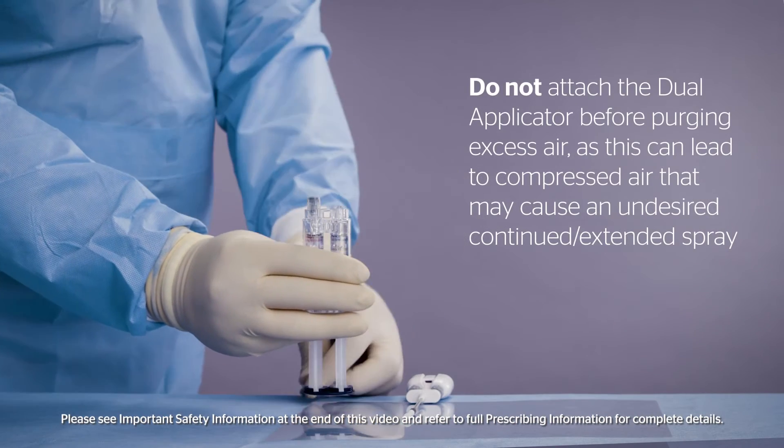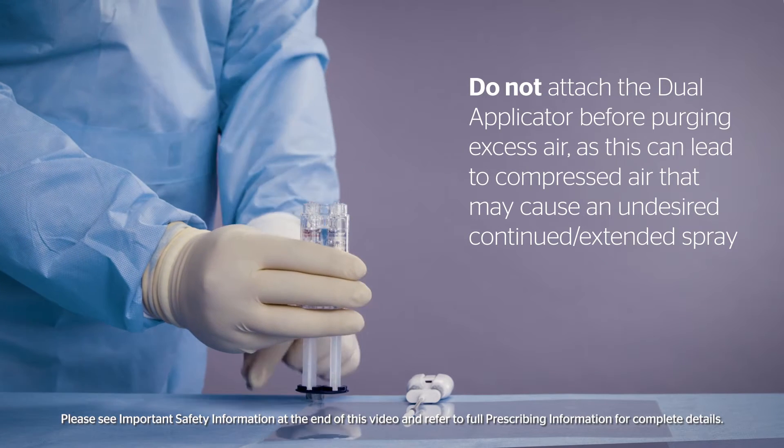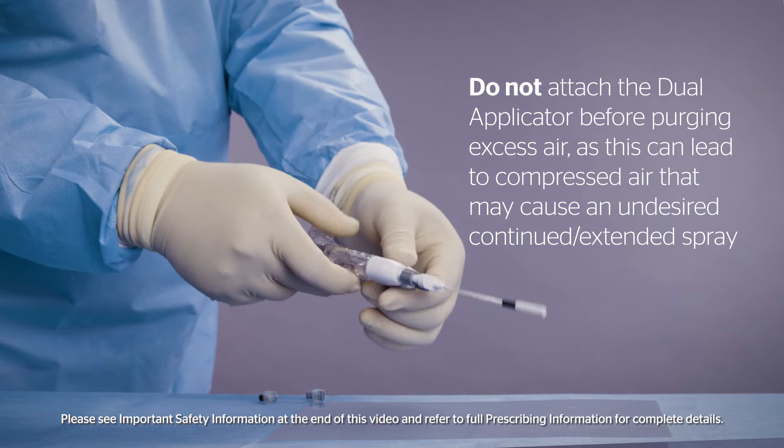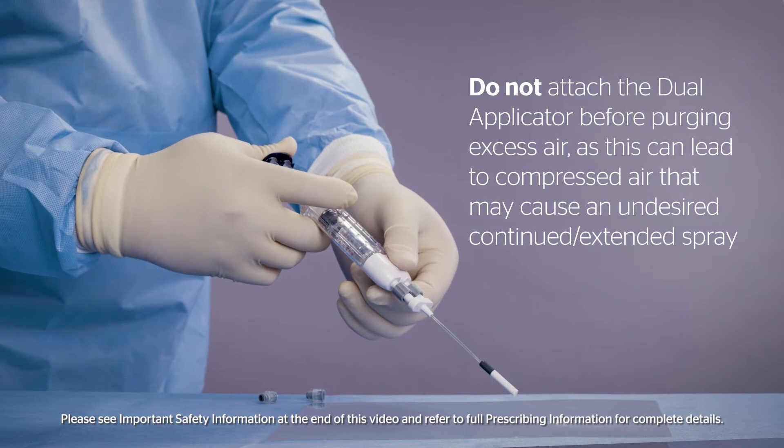Do not attach the dual applicator before purging excess air, as this can lead to compressed air that may cause an undesired continued or extended spray.